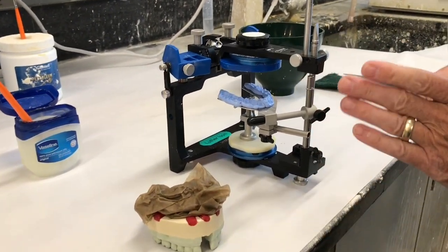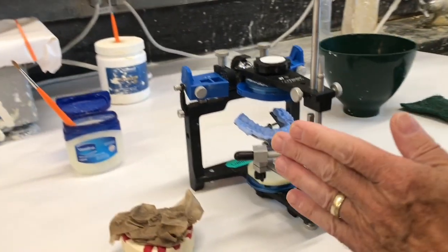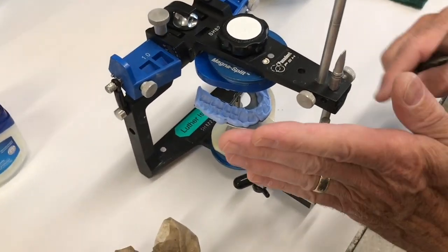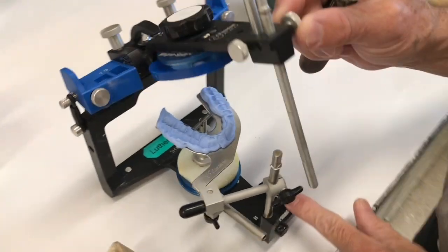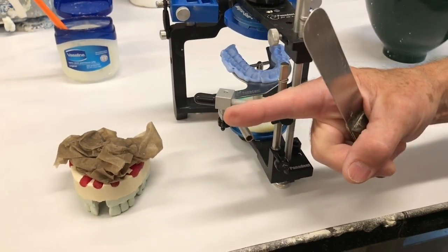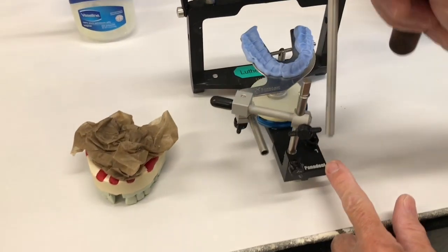And it goes up and down. The student or instructor took the face bow properly, angled this way so that this pin doesn't hit the knobs. If they take it so that this is out here angled, then this pin is interrupted by that knob.